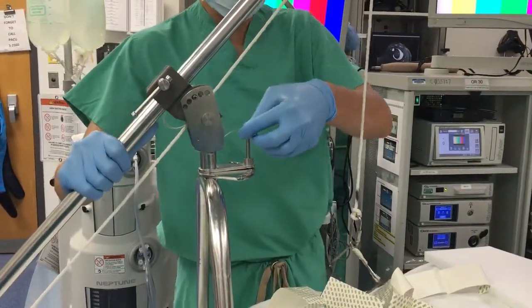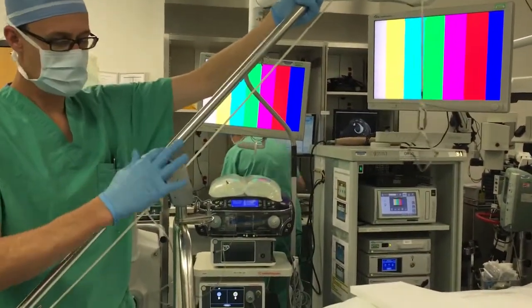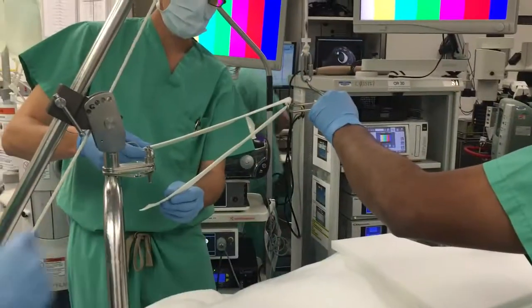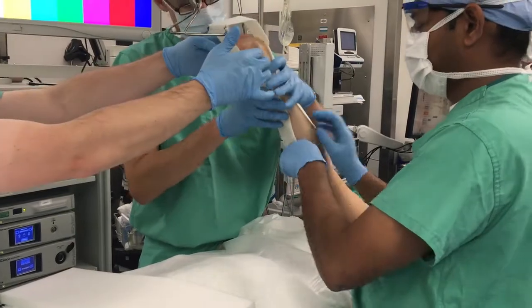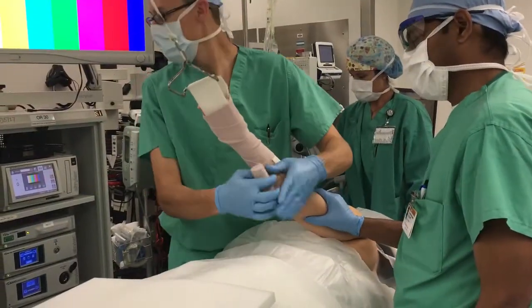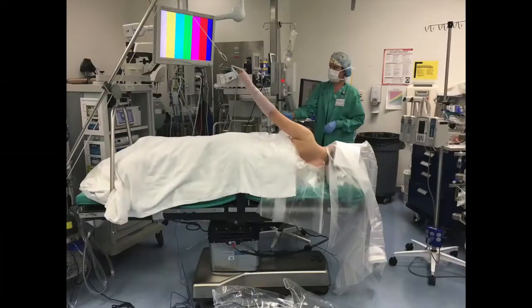The operative extremity must now be placed in traction. At our institution, we use a Dionics A-frame pulley system attached to the caudal end of the operating table. The A-frame is adjusted so the arm will be in full extension at the elbow when in traction. A skin trac made by Zimmer is threaded through the end of the A-frame, which is then attached to the patient's operative forearm, with care being taken not to compress the hand to avoid any neurovascular complications. The operative extremity is then wrapped in an ACE bandage and traction is placed on the other end of the A-frame. The senior author uses 10–12 pounds for women and 12–15 pounds for men.